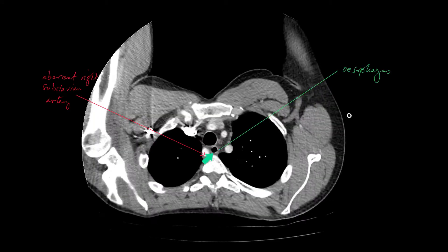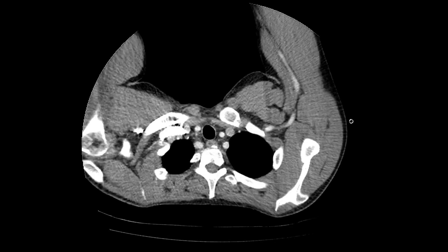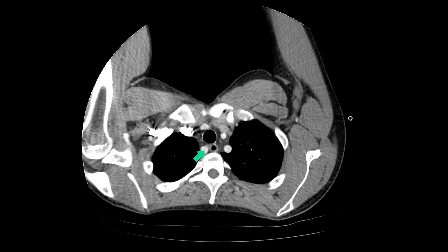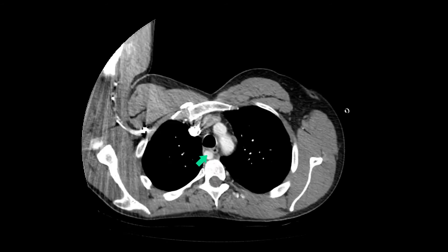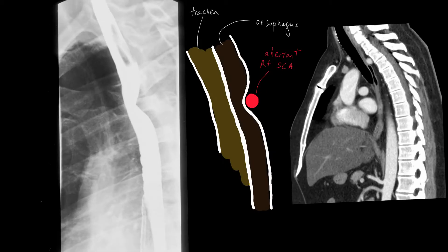Here is the right subclavian artery. On a lateral barium swallow you can see the indentation made by the aberrant right subclavian artery on the barium column. Here is the trachea anteriorly. Here is the esophagus. And this is the impression made by the aberrant right subclavian artery.